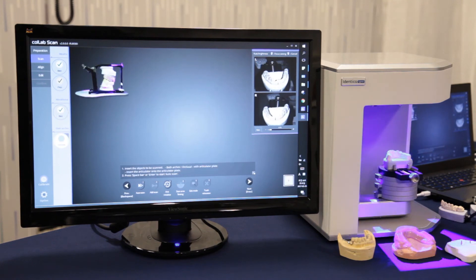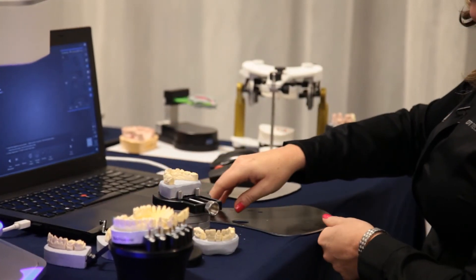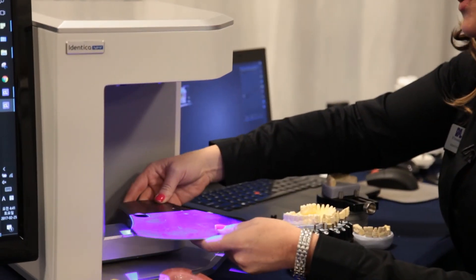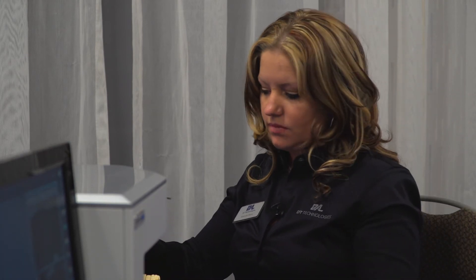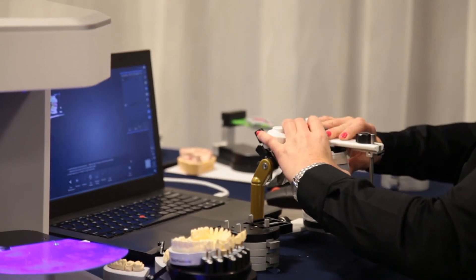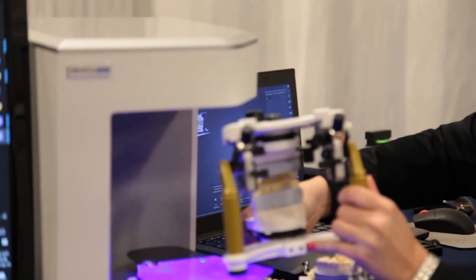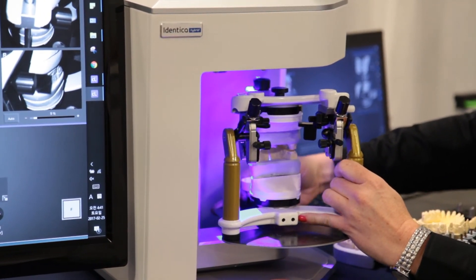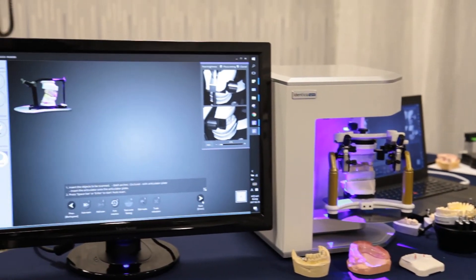We'll continue by placing the articulator plate into the scanner. You'll see that the scanner has rotated in a way that allows us to place the articulator plate in — if it has not rotated, do not place the articulator plate in. We'll put our models onto the articulator, then place the articulator onto the plate. There is a coating on the articulator plate that allows the articulator to stay steady on the plate during the scanning process. We'll continue by hitting next.